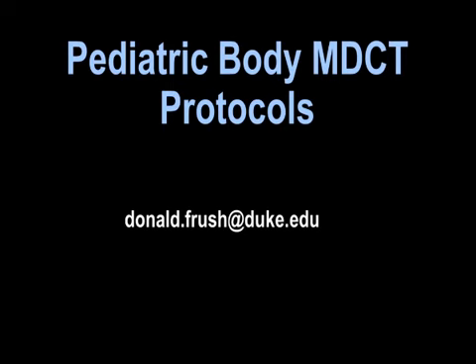We don't, but that makes perfect sense. And if you just need some limited information, like through a ureter or a kidney, is the bladder leaking, those are perfectly reasonable things to do. Again, it's a nice technique to tailor that individual scan to what you need on those delayed images, because you're right, we often don't need to see stem to stern on those. So in addition to turning down the technique to acquire less tissue, irradiate less tissue along the way is certainly reasonable.